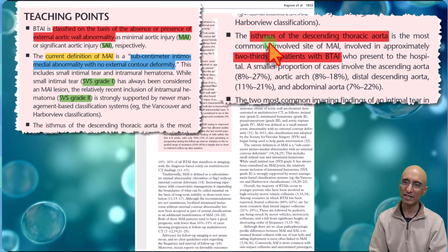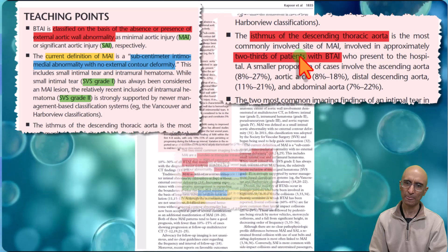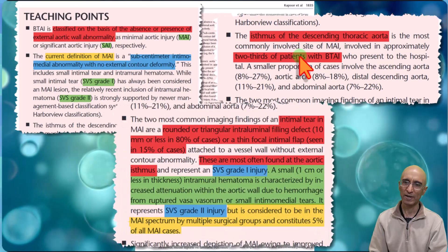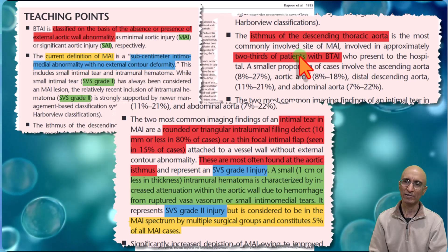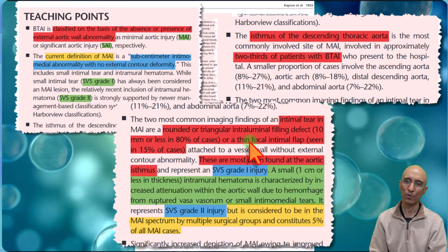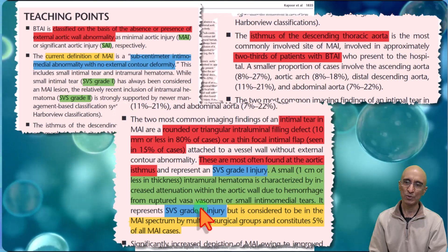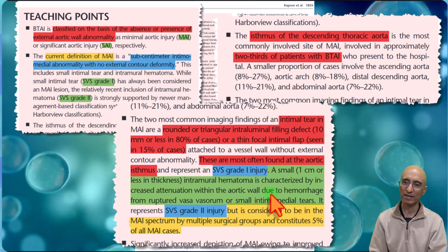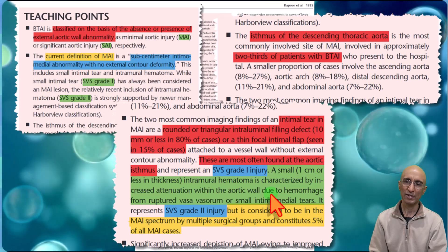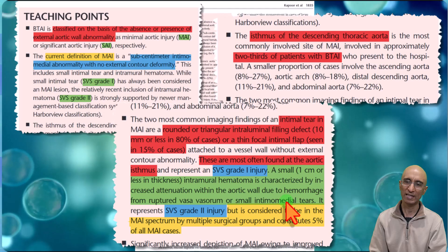The lesion is commonly seen in the isthmus of the descending thoracic aorta. SVS grade 1 injuries are characterized by round or triangular intraluminal filling defects less than a centimeter, or a focal thin intimal flap. SVS grade 2 injuries are characterized by small intramural hematoma, likely related to ruptured vasa vasorum, or small intimo-medial tears.